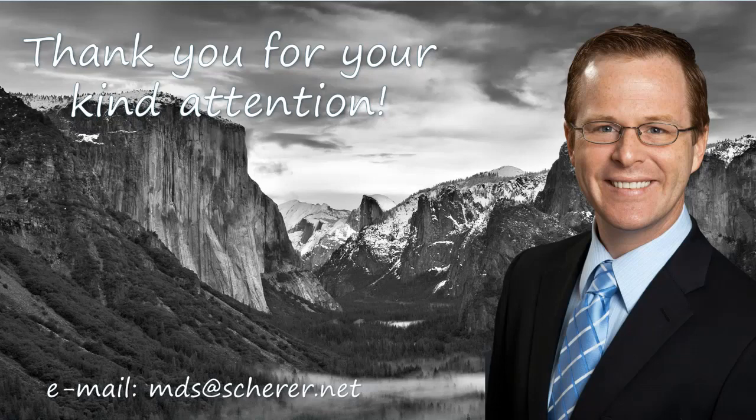The interesting thing is that I've seen a fair number of 2-implant maxillary overdentures that do okay. I don't know if I would necessarily go out on a limb and publicly advocate that. I really think it's a good idea to consider a minimum of 4 implants for your maxillary cases. In fact, I recommend 4 to 5, maybe even 6. Can 2 work? Yes, I've even seen 1 on the maxillary arch with a palateless denture work. But remember, it's case selection, case selection, case selection.